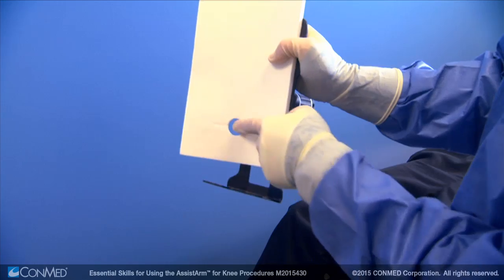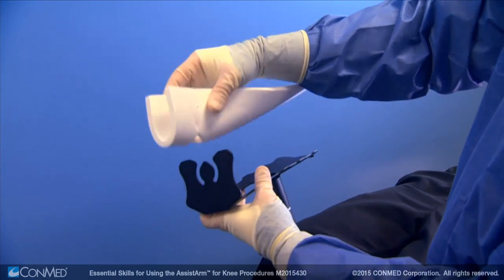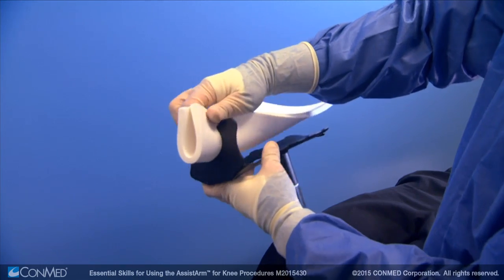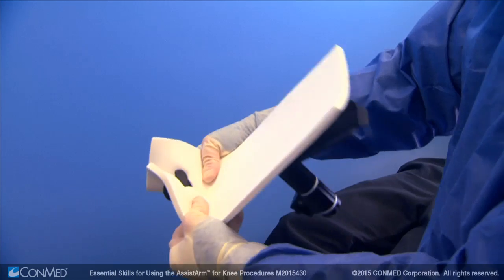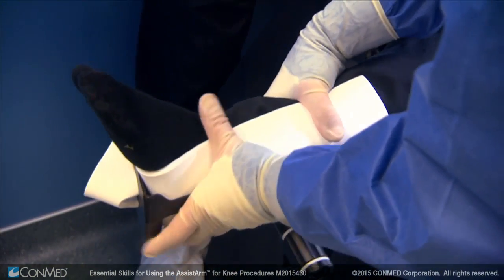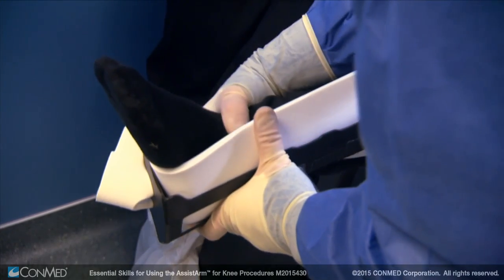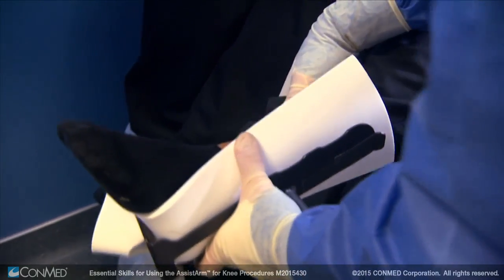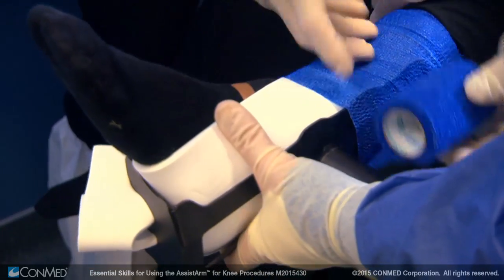To attach the foam pad to the knee attachment, bend it near the hole so it can slide into the grooves and press the pad against the attachment. Place the patient's foot in a stockinette and position it against the short part of the knee support, with the long side of the support running up to the lateral side of the patient's leg. Secure with the provided sterile bandage.